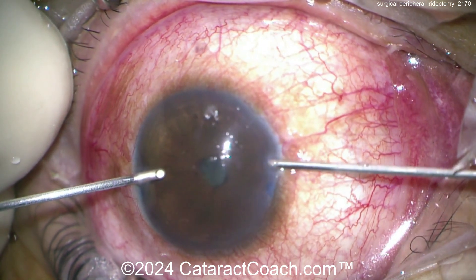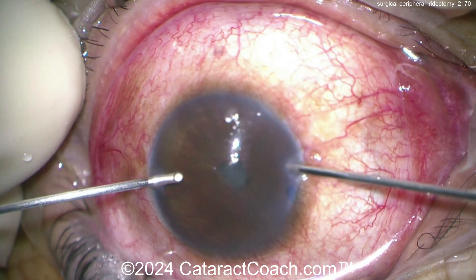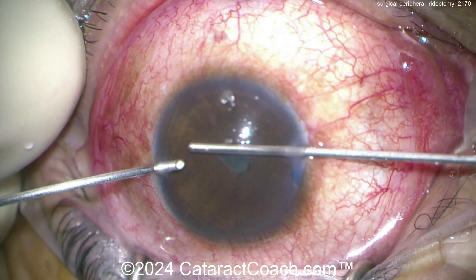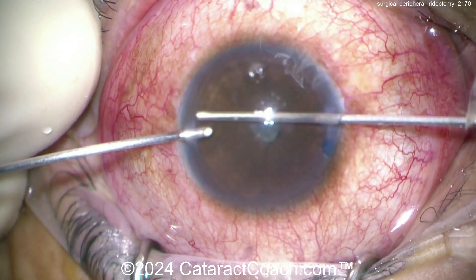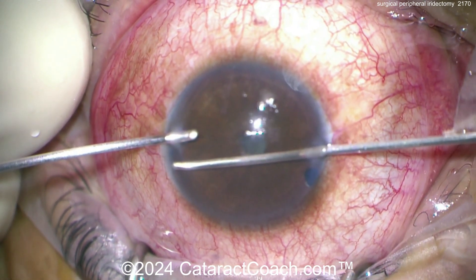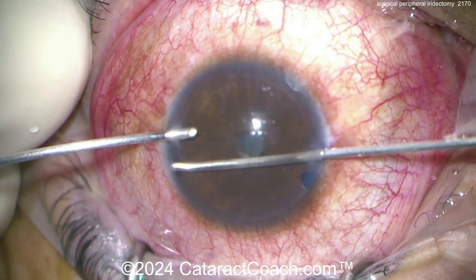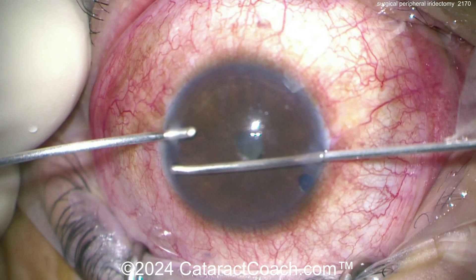Use a higher infusion pressure to keep the anterior chamber as deep as you can. Going in and coming across the eye — the surgeon's having a little bit of a tough time getting inside but there we go. Sitting superiorly, making both peripheral iridectomies in that superior area. Pivot the right hand — more, more, more — until you get out to the periphery. Position two for a little vacuum, port down on the vitrector. See the iris sucking into the port, then one or two clicks on position three. That should be sufficient.